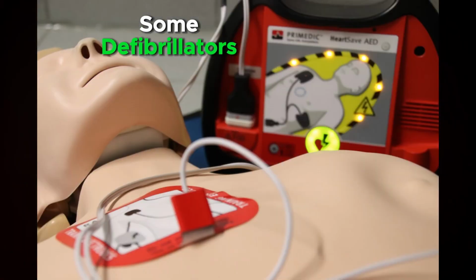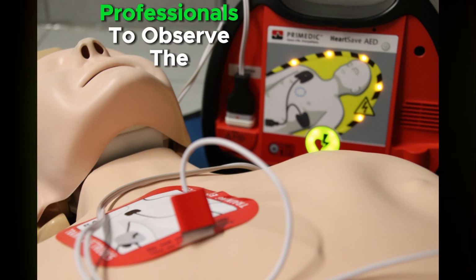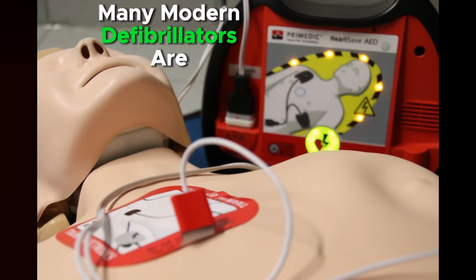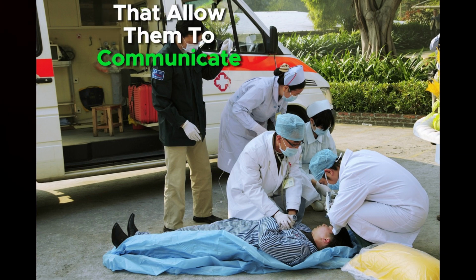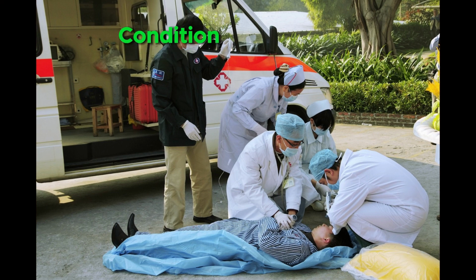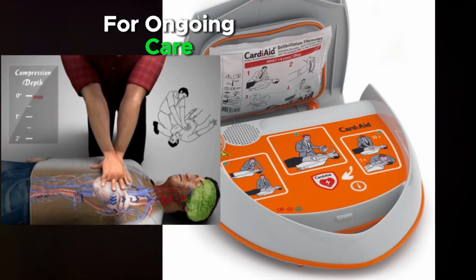Some defibrillators, especially those used in hospitals, offer continuous monitoring capabilities. This allows medical professionals to observe the patient's heart rhythm continuously and intervene as necessary. Many modern defibrillators are equipped with features that allow them to communicate with emergency medical services. Information about the patient's condition and the shock administered can be transmitted to medical professionals for ongoing care.